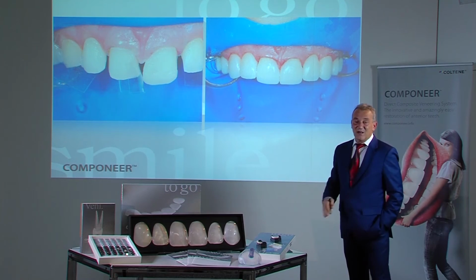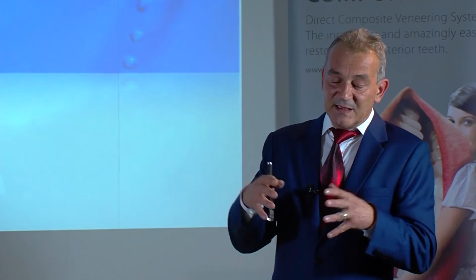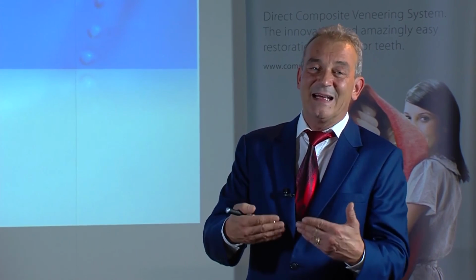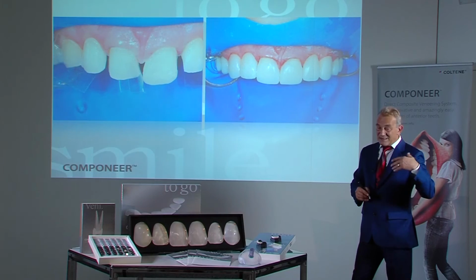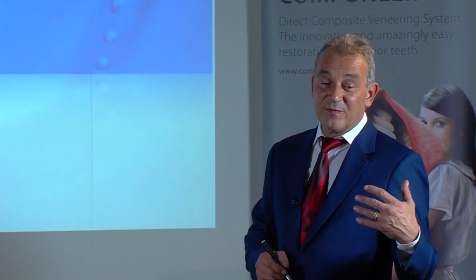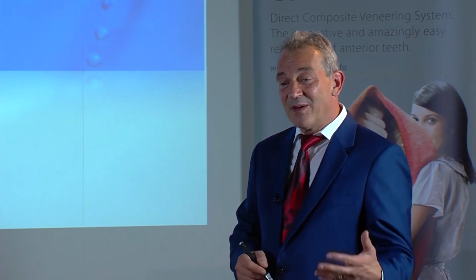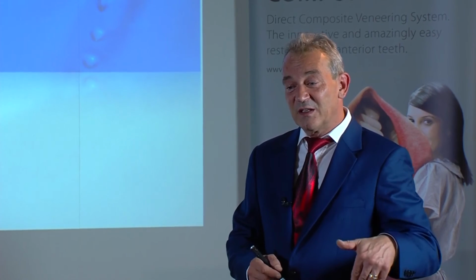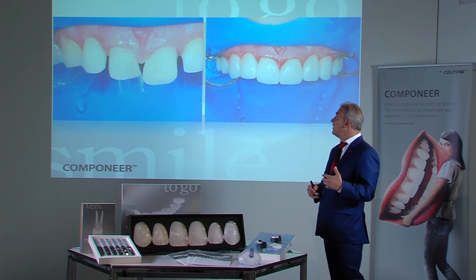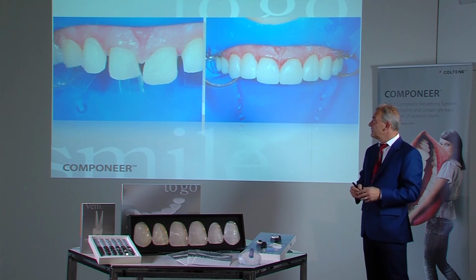One pushes this matrix along the tooth surface up to the retraction cord. The matrix is then jammed between the retraction cord and the tooth surface. In this situation, the primer is of special advantage, as we cannot work in the depth with phosphoric acid. The primer lets us condition the surface without irritating the gingiva. This way, the gingiva does not start bleeding and also shows no irritation when primer is applied.